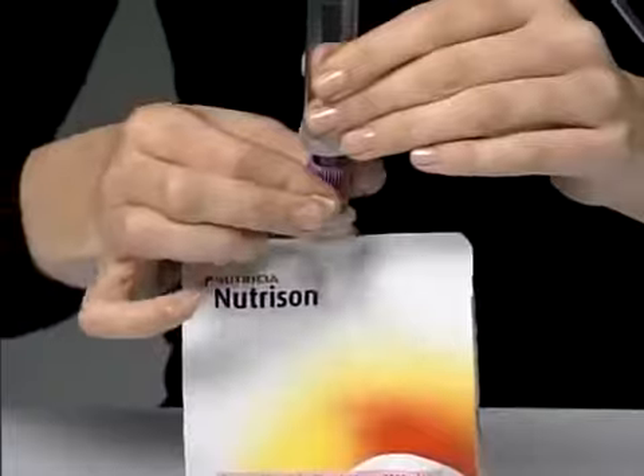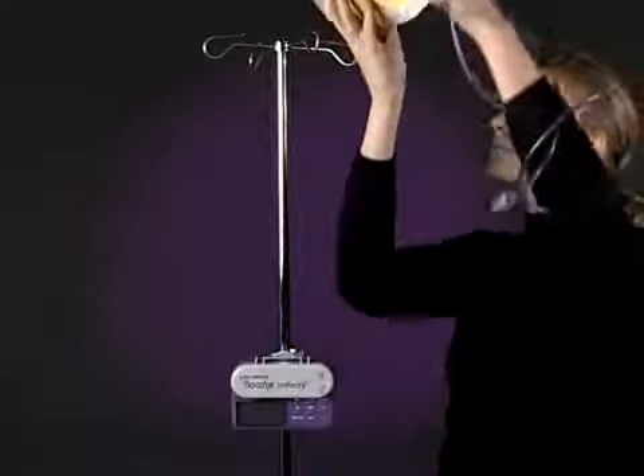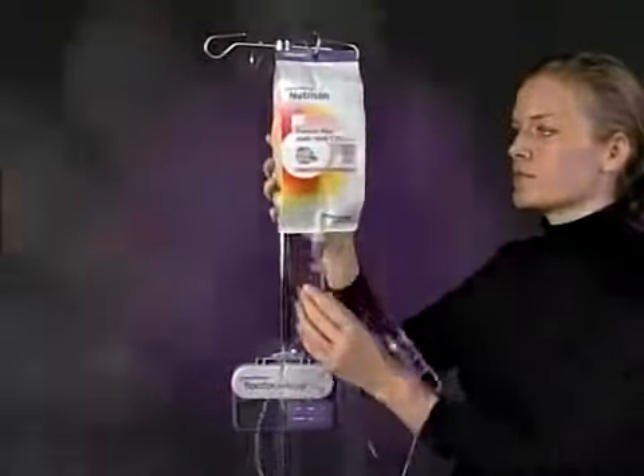Screwing on the cap is a smooth, gentle action — no force is necessary. Hang the pack above the pump on the drip stand. Check that the connection is secure before advancing the spike.